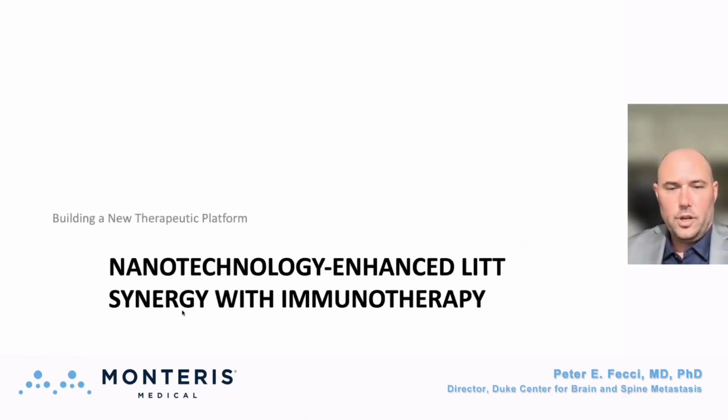Some fun, cool stuff that we said we would leave some room for at the end. We are working with our biomedical engineers to employ nanotechnologies that both expand LITT coverage and lower the energy needed to do it, as well as create specificity for tumor borders, which makes LITT both safer and able to cover larger lesions, and finding ways to combine that with things like immunotherapy.